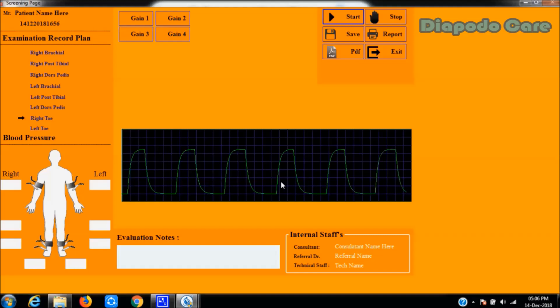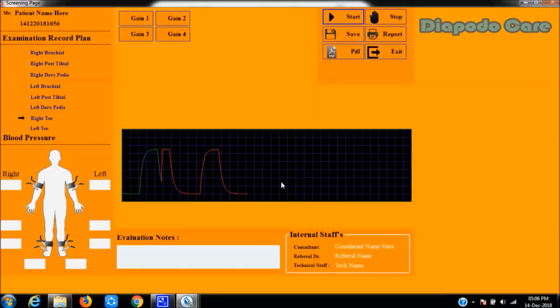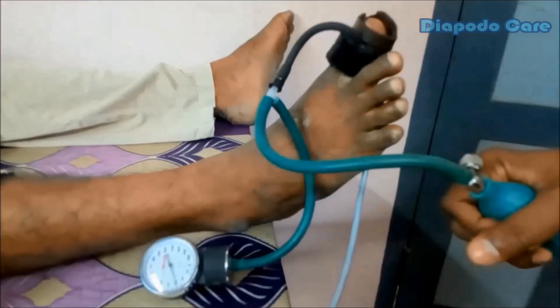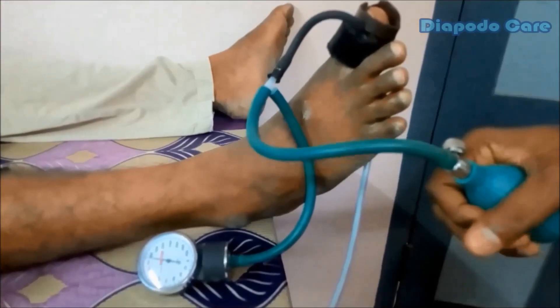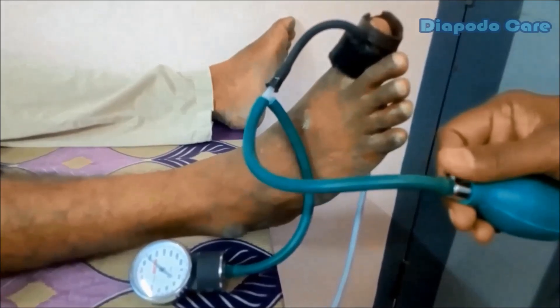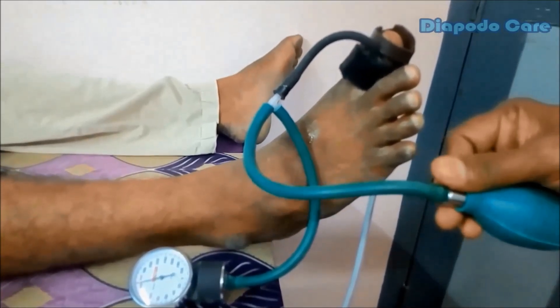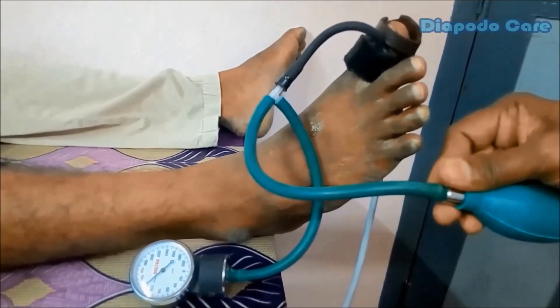The toe waveform will be shown as demonstrated in the video. While pressing the foot switch, the 3-second sample recording will appear in red. After recording, perform the BP measurement. In the toe pressure procedure, visual observation of the software screen is required due to the absence of audio output.